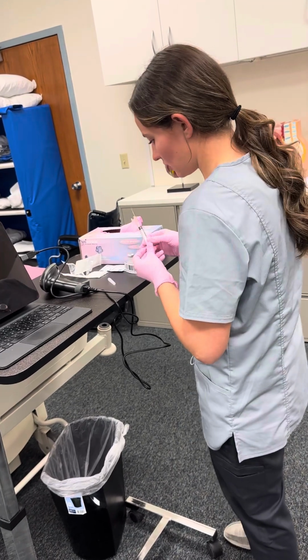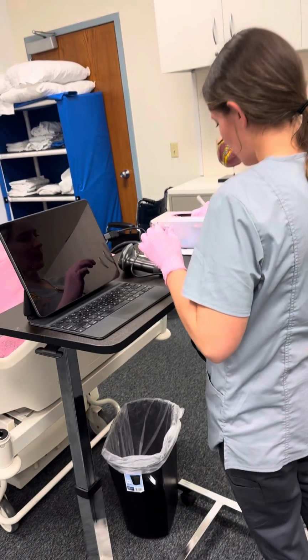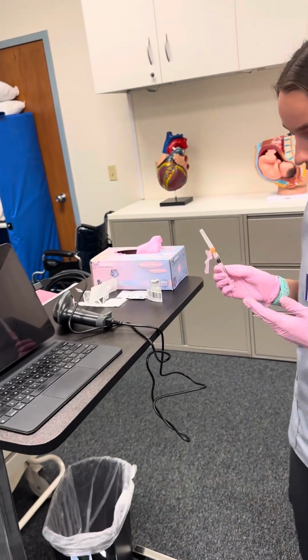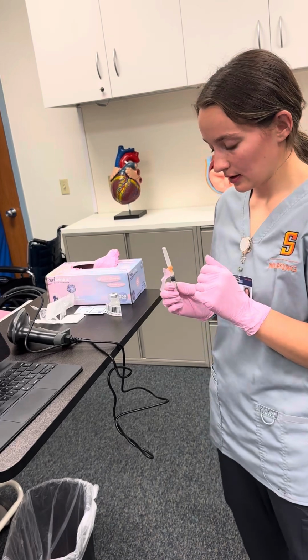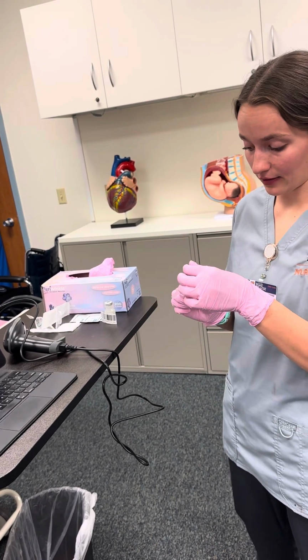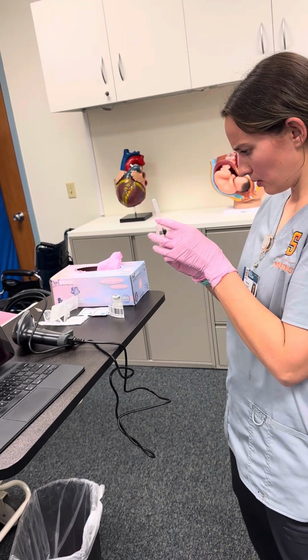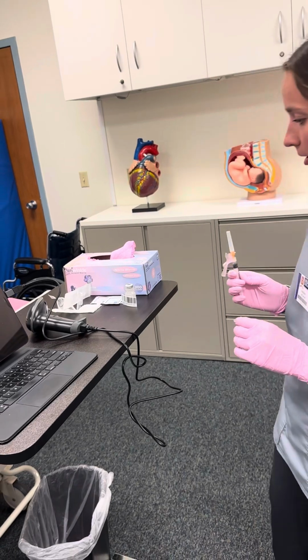Okay, and then I'm going to do the scoop method with my needle. And if I contaminated it or if I bent it, I would have to redo and get a whole new thing. Also, see you can get all the bubbles. It looks good there.